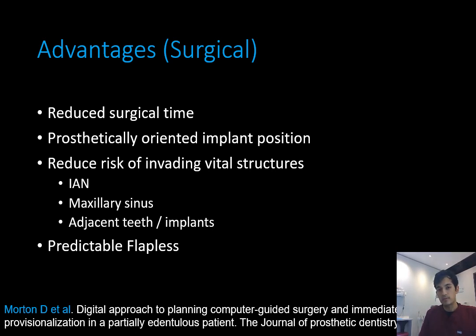Secondly, the need for x-rays. Previously, I would take an x-ray after the initial drill, and if any corrections were needed, I'd take x-rays after each correction to verify I'm in the right place, an x-ray after the final drill, and then an x-ray when the implant goes in. With guided surgery, I know that the drill is going to go in the right place once I've verified that the guide is seated. Now, out of habit, I still take an x-ray after the first 2mm drill goes in, and I take an x-ray after placing the implant to verify the depth of placement. But seldom do I have to correct anything when doing it digitally, and these are purely for documentation purposes at this point.